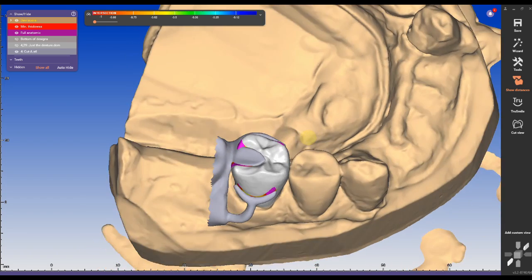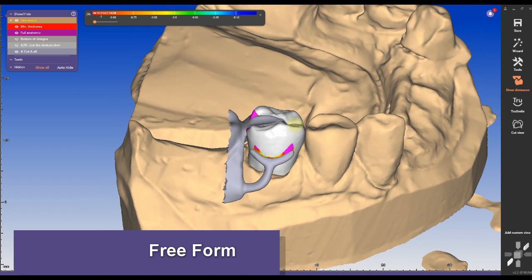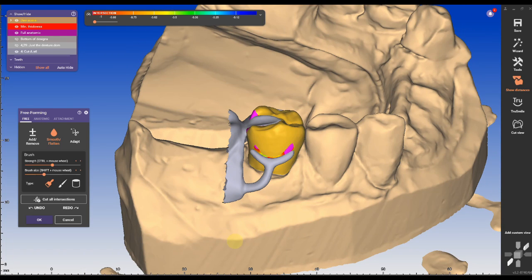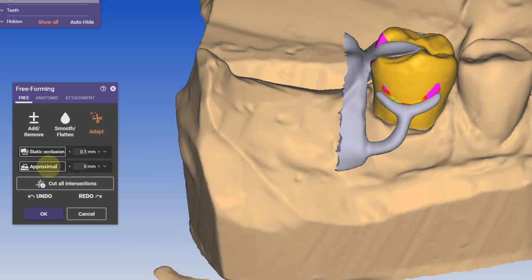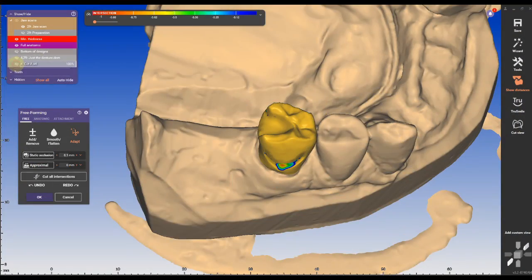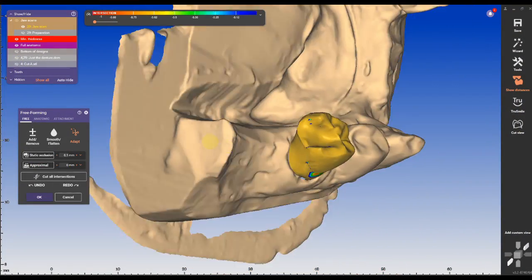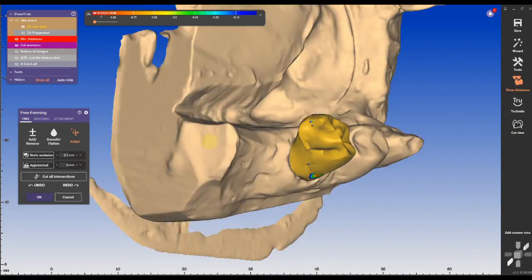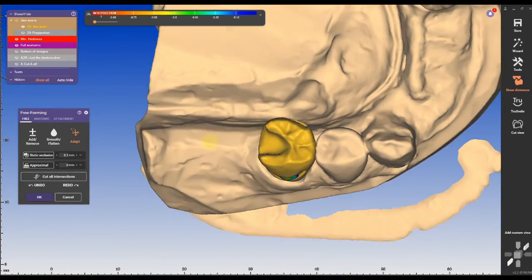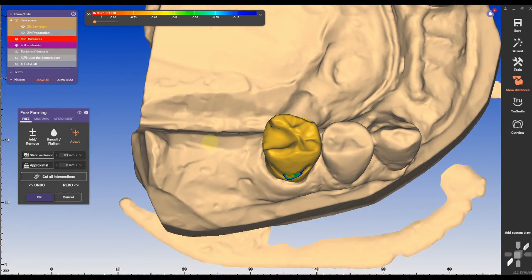Then we're gonna go to freeform, go to adapt, and going to static occlusion and proximal again. If we reduce the preparation scan we can see that the occlusal rest and the clasp were exactly reduced from the crown preparation.